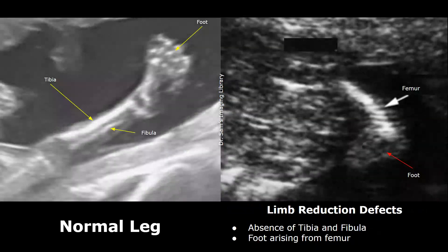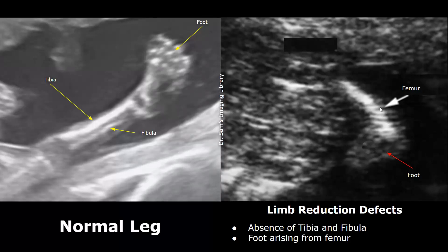Limb reduction defects are often associated with Edwards syndrome. Absence or reduction in size of any long bone can occur. The image on the left shows a normal leg and foot with both the tibia and fibula visible. The image on the right shows a femur without the presence of tibia and fibula — both are absent and an abnormal foot is arising directly from the femur.